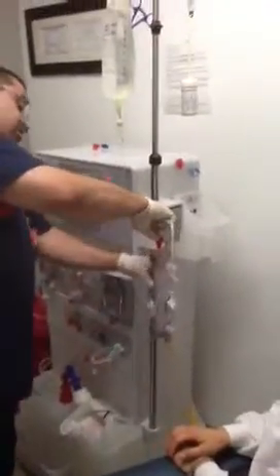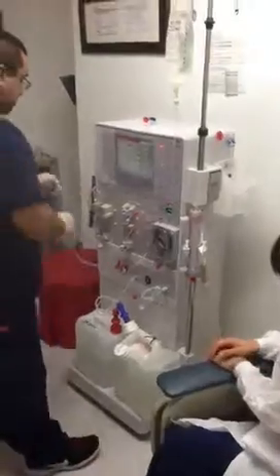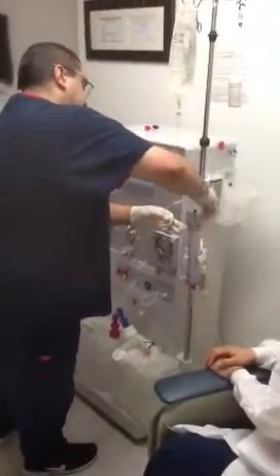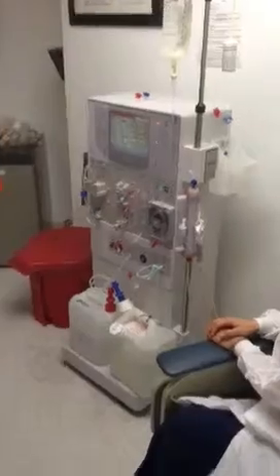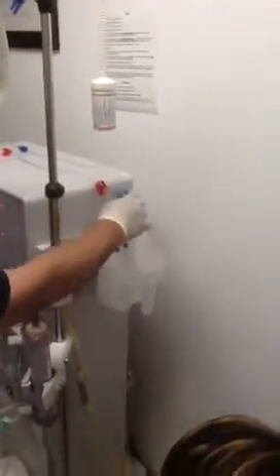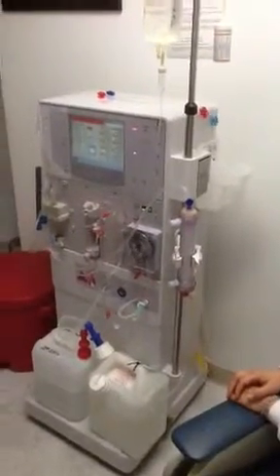Then connect the arterial bloodline to the arterial side of the dialyser, which is the numbers on the arterial side. Once you have that connected, flip your dialyser. Get your venous bloodline to the dialyser and connect it to the venous side of the dialyser. Push start and lower the blood flow to 200. Wait until the prime stops — it will prime about 300 cc of saline through the dialyser and empty it out through the venous into the bucket. It's rinsing out any remnant or air in the dialyser.